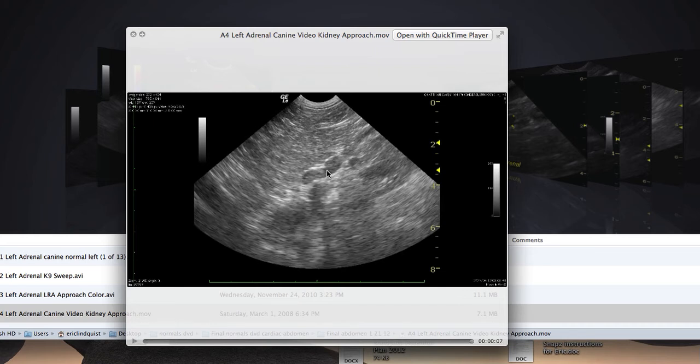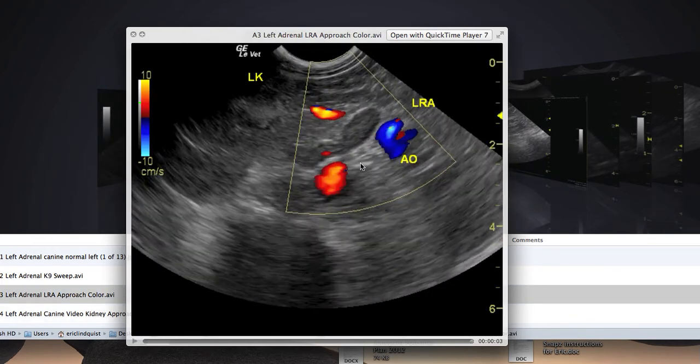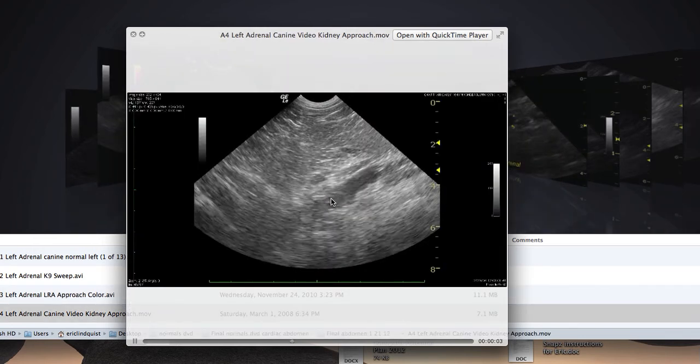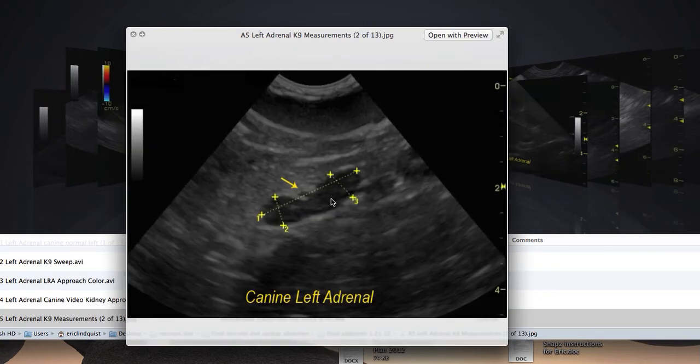It's the alternative approach. I find it more tedious to go from a larger structure and focus on a smaller one, when I'm already looking at a one-centimeter structure on the aorta and then looking for a near one-centimeter-wide left adrenal gland, already minimized regarding the distance from probe to structure and scanning in a focal zone of about two to three centimeters. But this is a more traditional approach and every animal is different — sometimes you can get it with one approach or the other. You always have to have two different approaches.